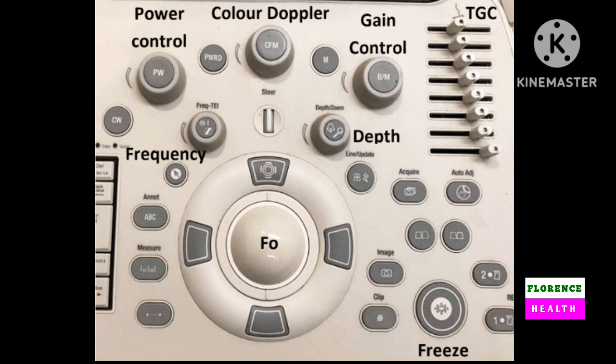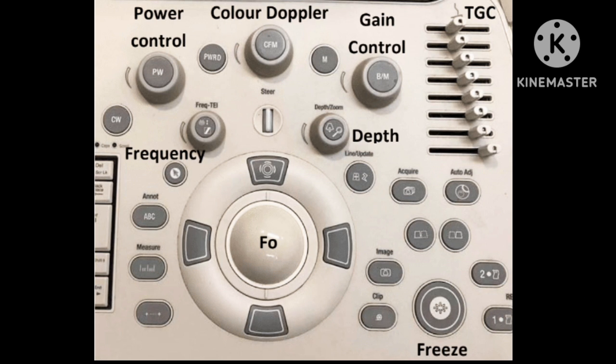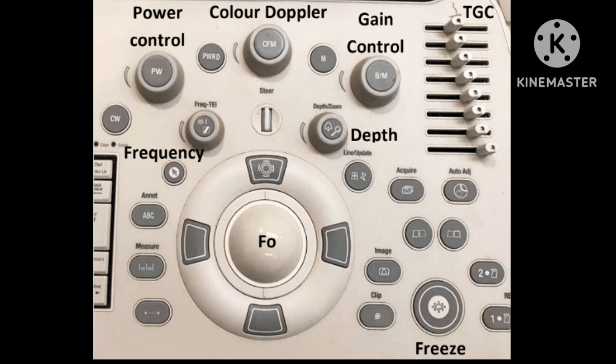Again I am telling, there are three types of knobs present in every ultrasound machine: rotating knob, pressing knob, and sliding knob. I have already discussed each knob in detail in previous videos. Go and see the videos. In this video I will discuss it very briefly.